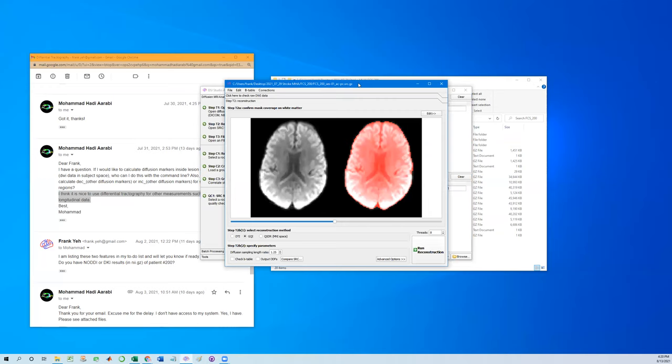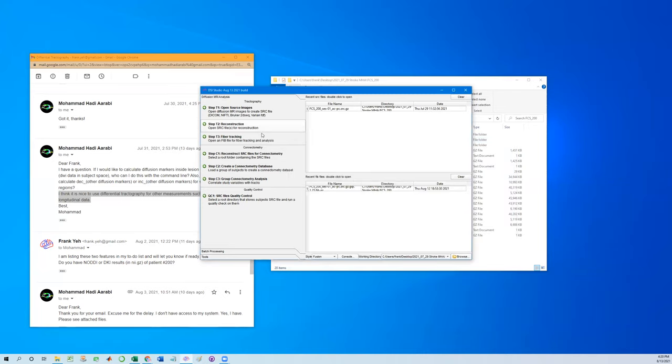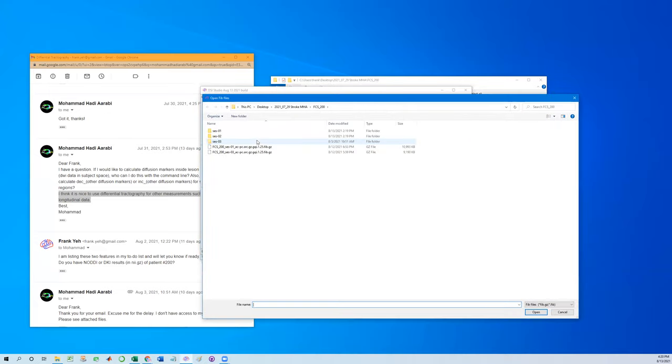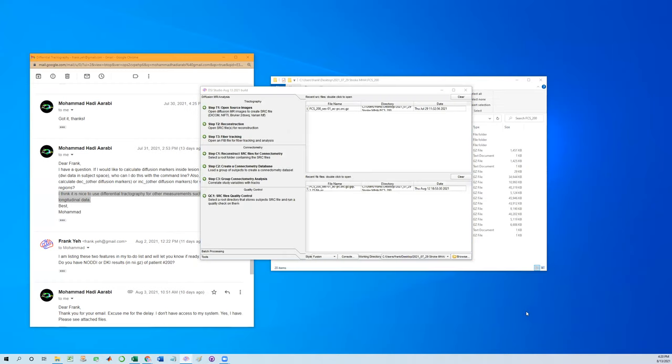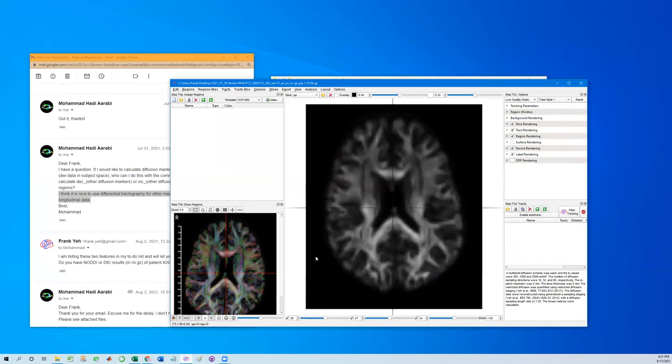So I pick up the first scan and simply run GQI reconstruction to create a FIB file. Once the FIB file is created, so this one is only created using the first scan, then we can show how the scan looks like in the baseline.